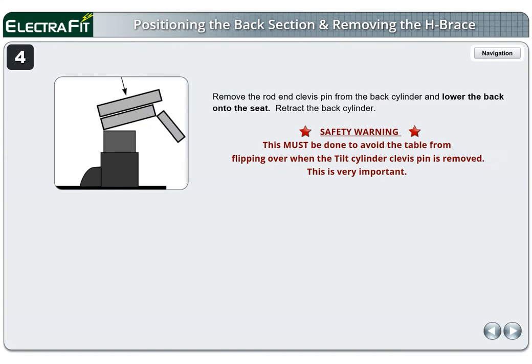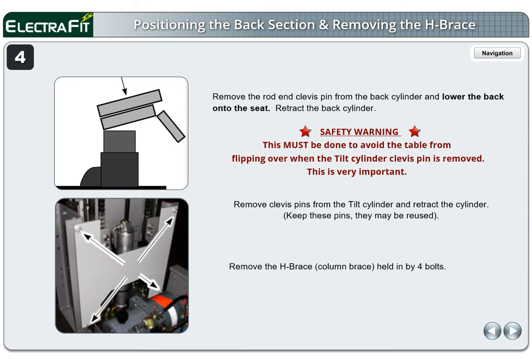Page 4. Remove the rod end clevis pin from the back cylinder and lower the back onto the seat. Retract the back cylinder. Safety warning: this must be done to avoid the table from flipping over when the tilt cylinder clevis pin is removed. This is very important. Remove clevis pins from the tilt cylinder and retract the cylinder. Keep these pins — they may be reused. Remove the H-brace, also called a column brace, held in by four bolts.